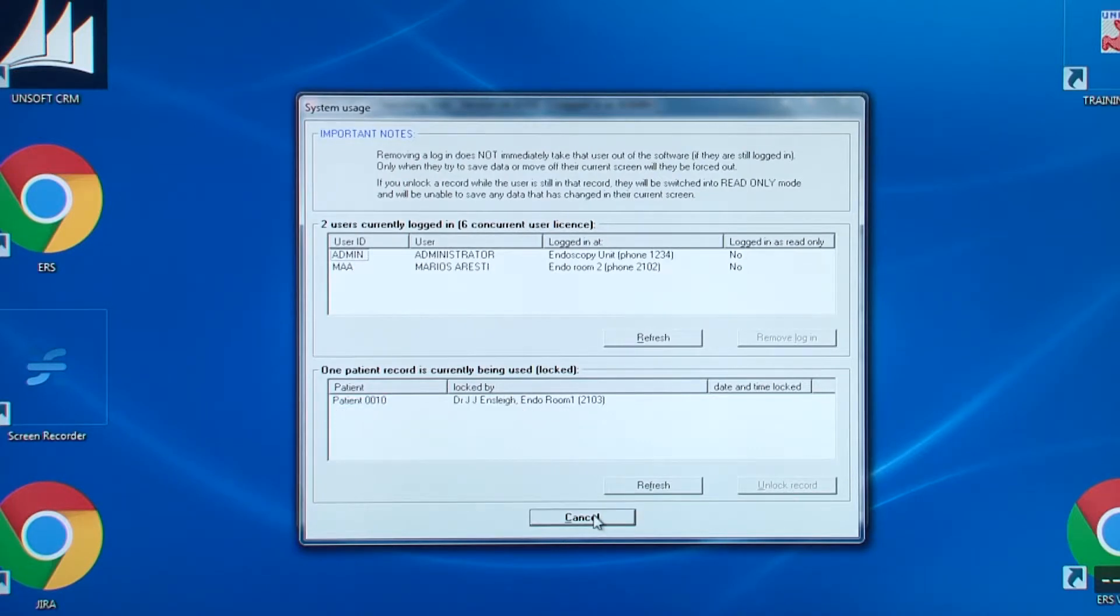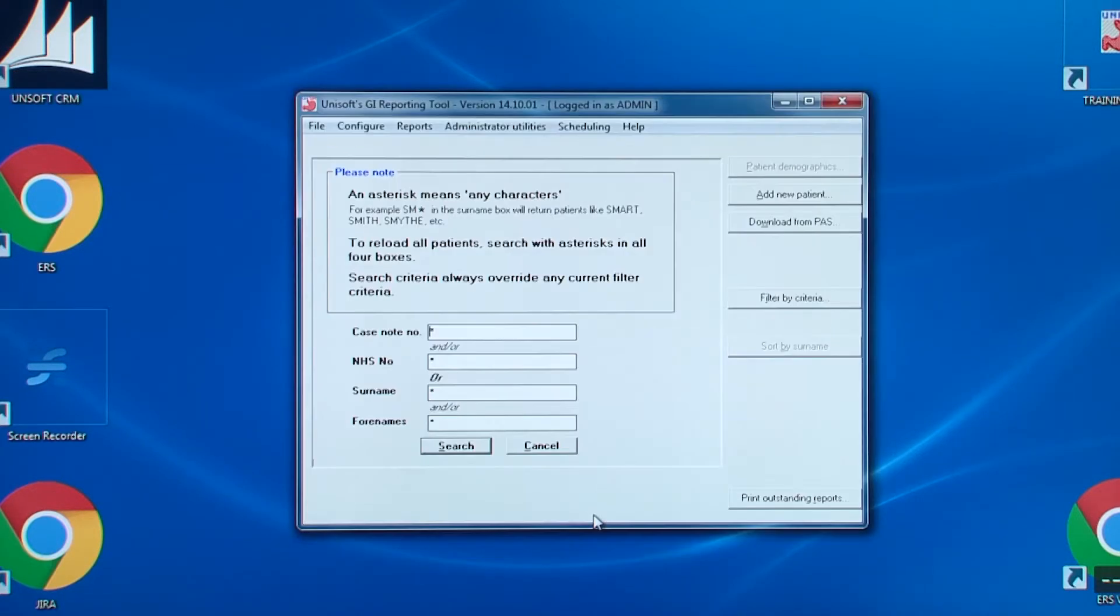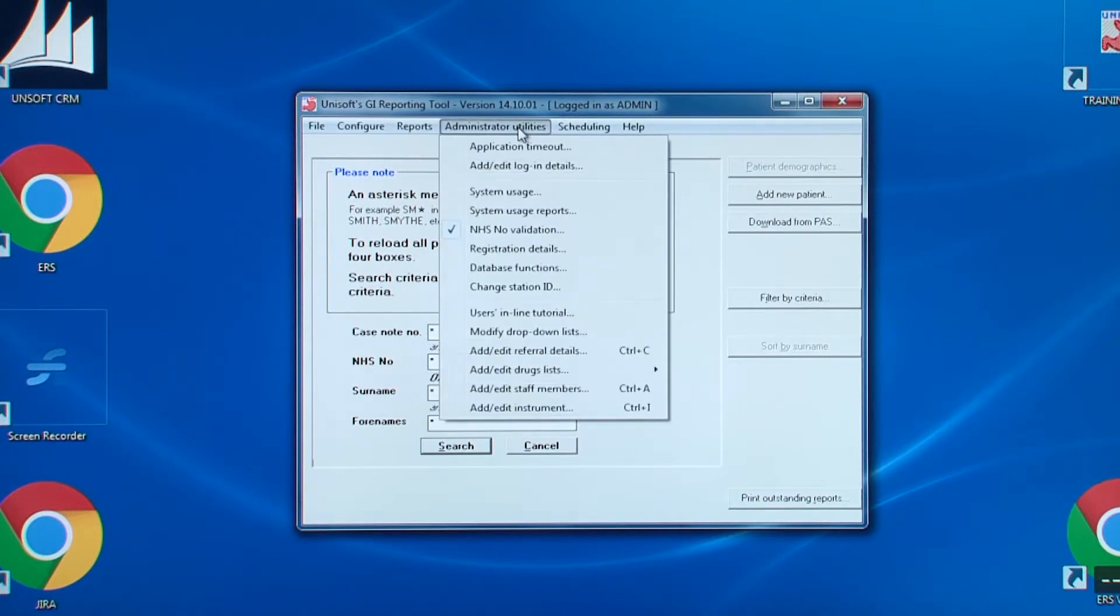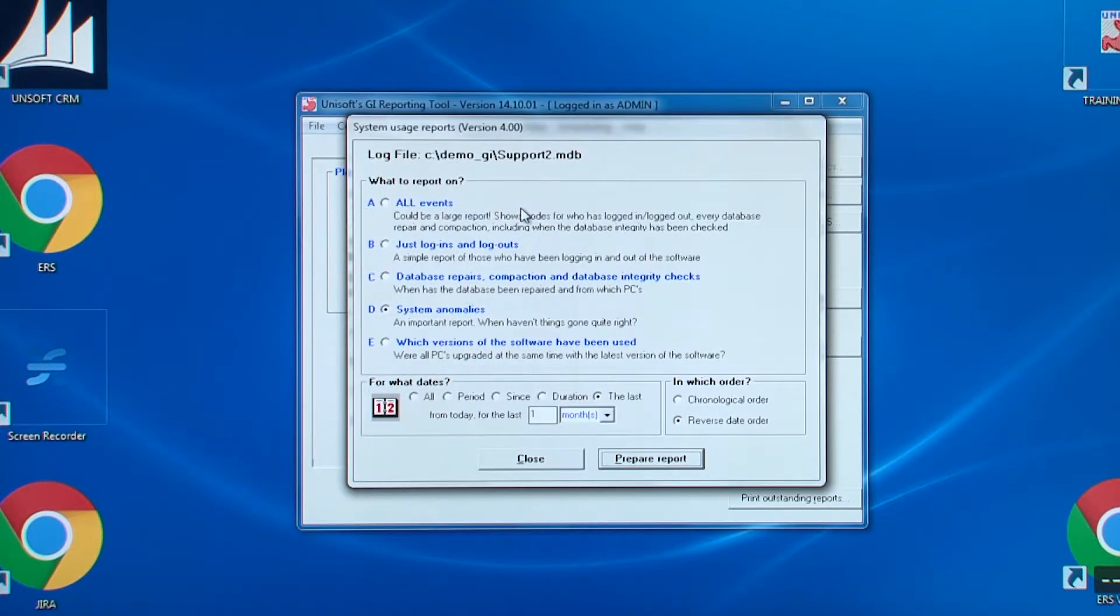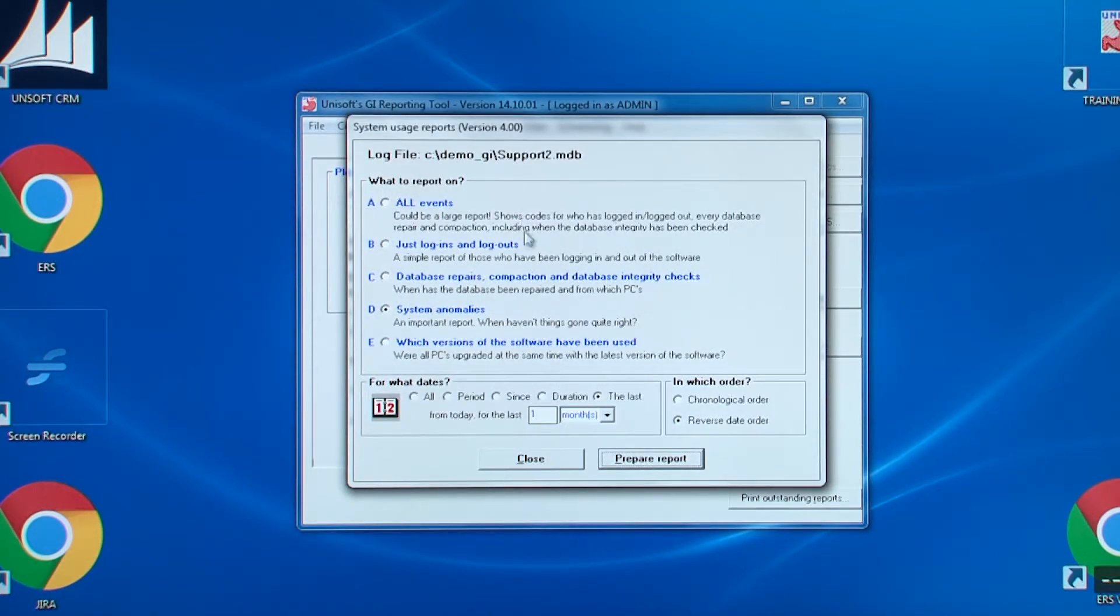The next entry on the administrator utilities menu is system usage reports. This is a legacy from earlier versions of the software and much of this functionality has been replaced by the audit log under the reports menu.